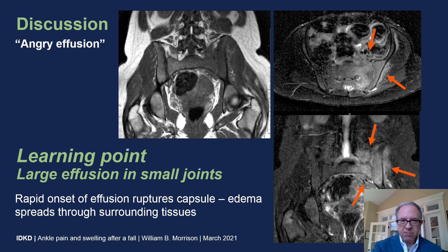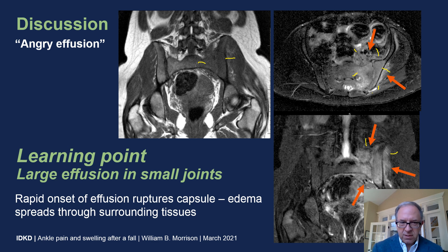Here's a different case with septic sacroiliitis to illustrate what I mean by 'angry effusion.' At the left sacroiliac joint we can see diffuse marrow replacement around the SI joint, diffuse bone marrow edema, and soft tissue edema around the SI joint itself extending into the adjacent soft tissues. This is the result of a small capacity joint with a rapidly expanding joint effusion, resulting in rupturing of the capsule and surrounding periarticular soft tissue edema.